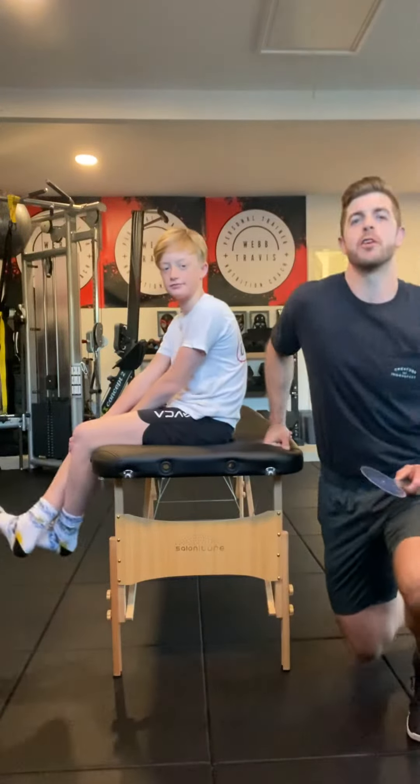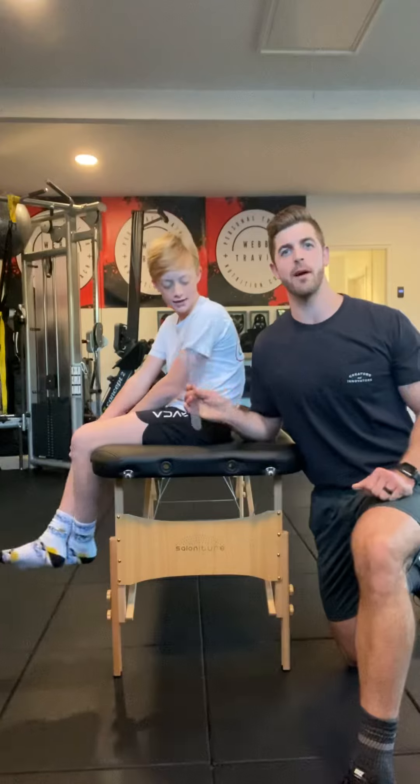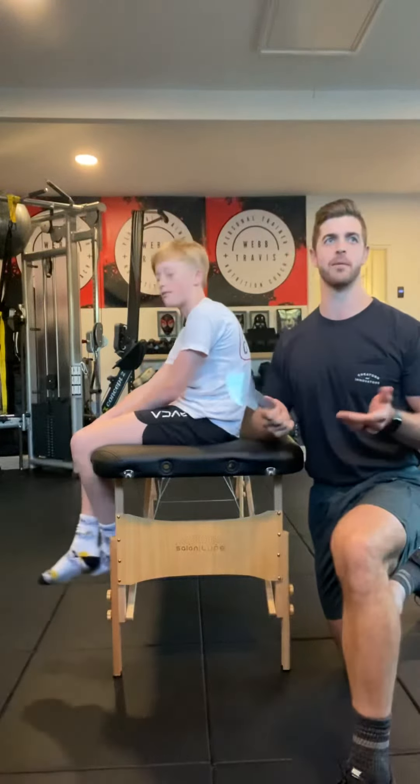All right, here we go — back in part two. We're going out for measurements and working with Mr. William Wilkins here today. We're doing shoulder flexion, very simple. Will, say hi.